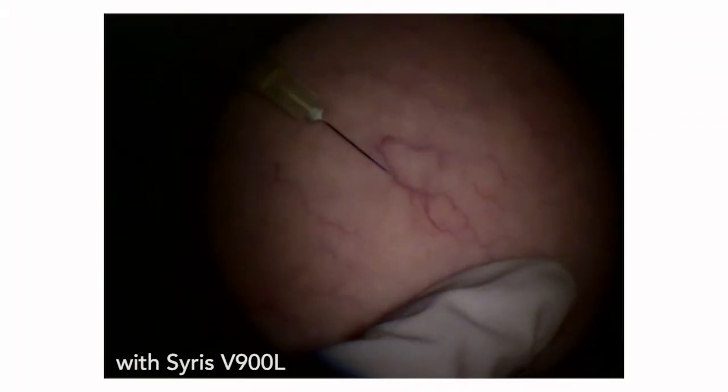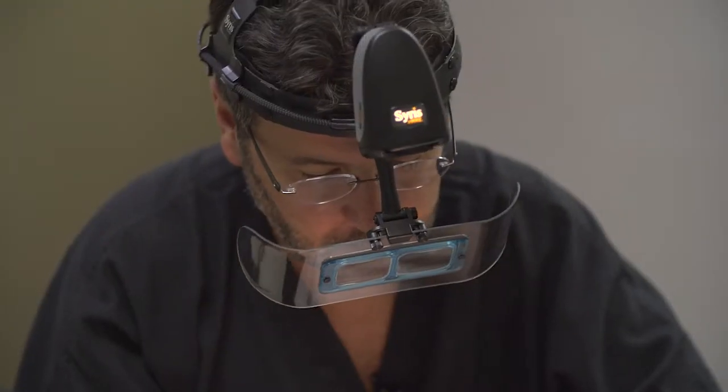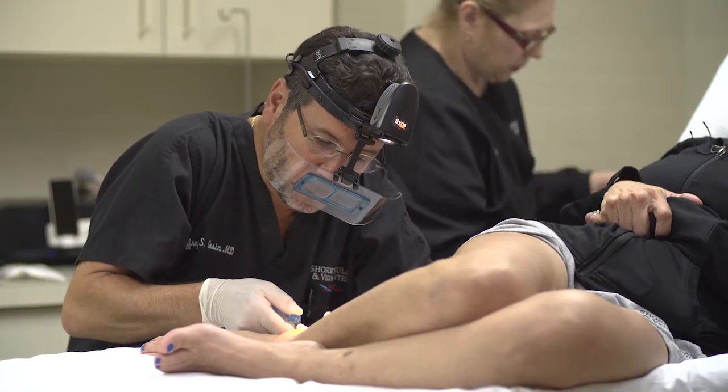It really limits side effects and problems and allows you to get the best possible results. Patients have very high expectations of what they want, and I'm not satisfied if my patients aren't satisfied. The V900 light gives me the confidence to know that I'm really using the best resources available to provide those excellent results to my patients.